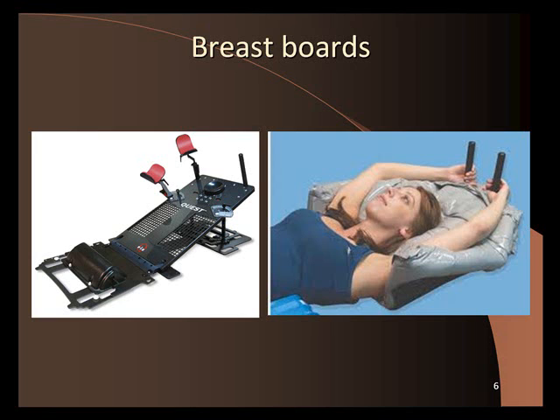Okay. So there's a vac lock, and you guys might have seen that. That's a bag full of these little foam BBs. You plug a really high-powered vacuum to it and suck all the air out after the patient lies down on it, and that form is maintained. And basically, that form should stay for the whole treatment, for the whole 2 months or whatever they're there for treatment. So that's vac lock, and then there's alpha cradle.